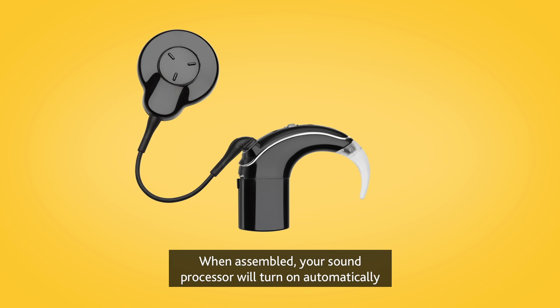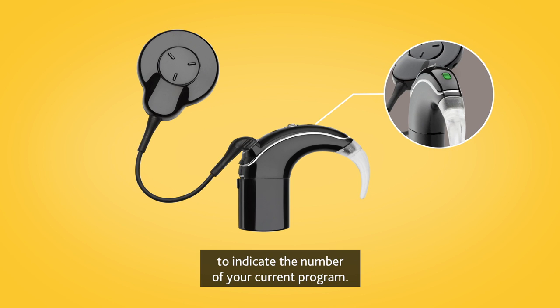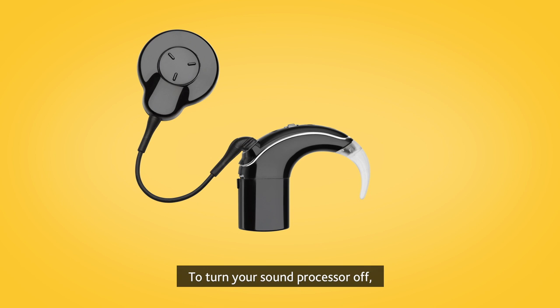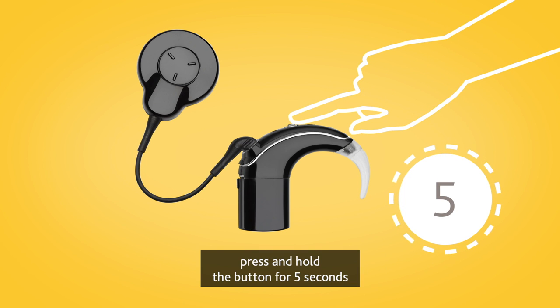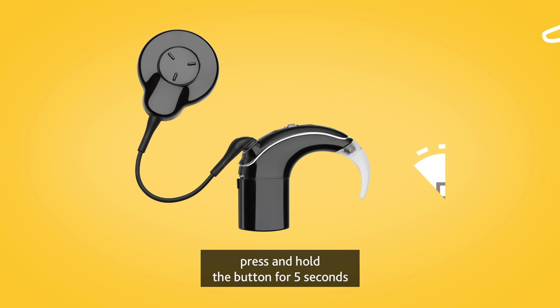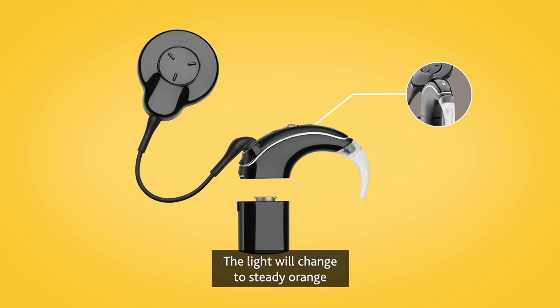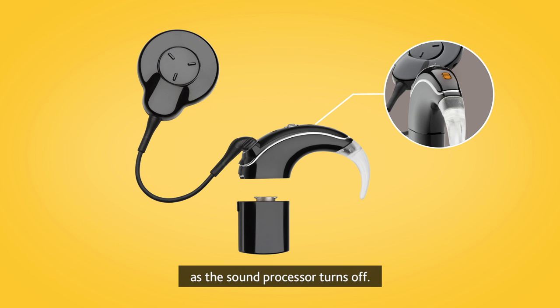When assembled, your sound processor will turn on automatically, and a green light will flash to indicate the number of your current program. To turn your sound processor off, press and hold the button for 5 seconds, or disconnect the battery. The light will change to steady orange as the sound processor turns off.